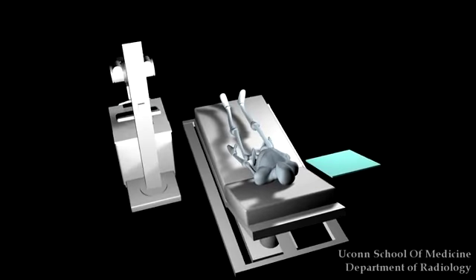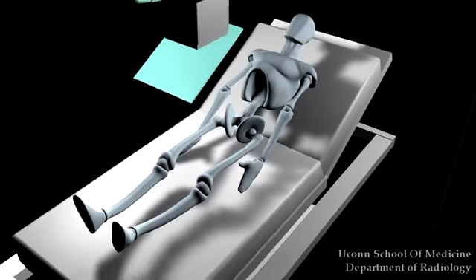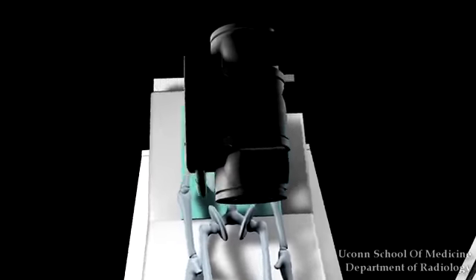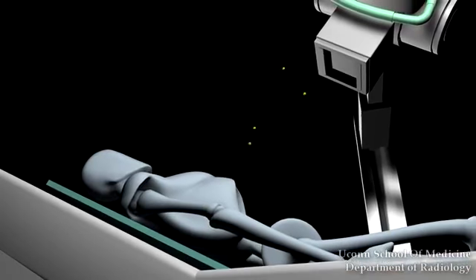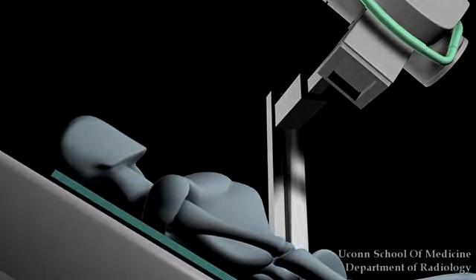The X-ray source is from a portable machine that is placed in front of the patient. An image detector is placed behind the patient. When the chest X-ray is actually taken, the X-ray beams pass from the front to the back, or anterior to posterior, of the patient. Thus, this would be called an AP radiograph.